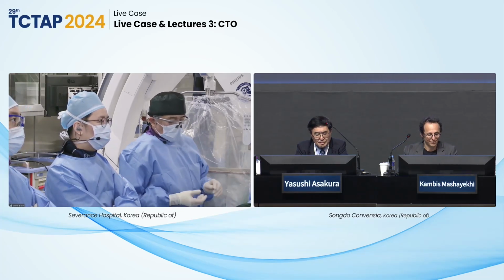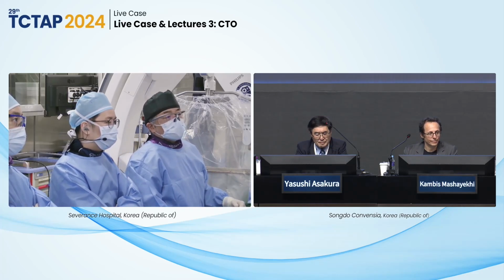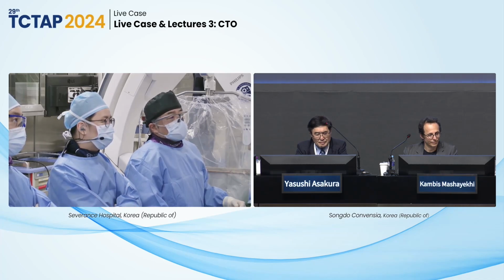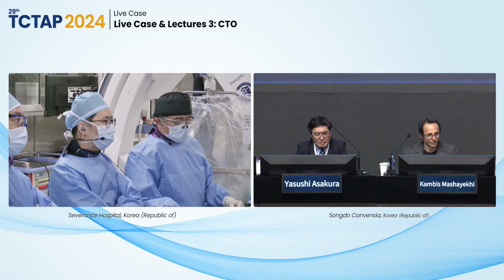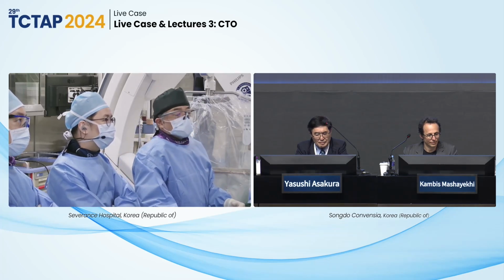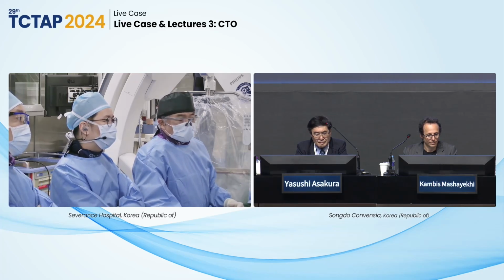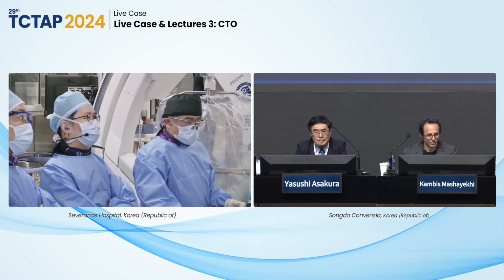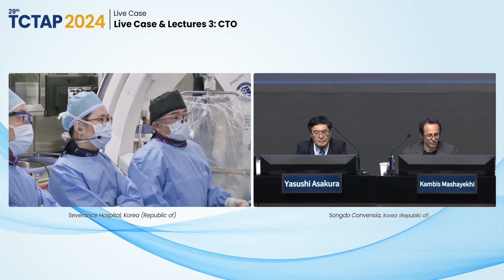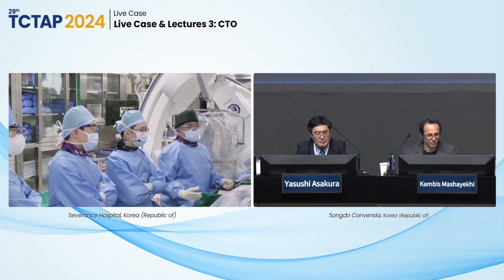Okay. So good afternoon, everyone. So this is the Yonsei classroom. So welcome to the classroom, our case. So today is the RCA CTO case. It's quite a long time to see you again. And then the moderator is Dr. Kambis, and it's a really great honor to perform the live demonstration. So today I am Byeong-Keuk Kim. The second operator is Professor Yongjun Lee, and the third operator is my two fellows.